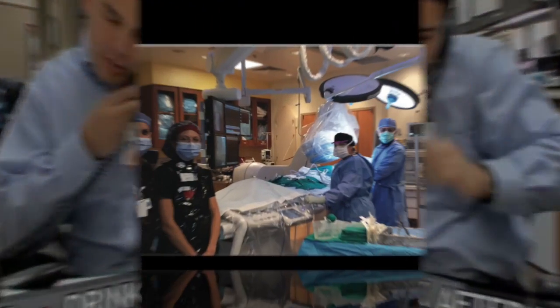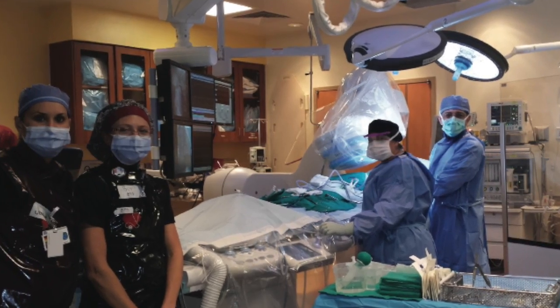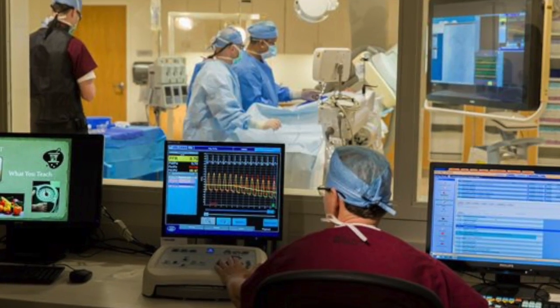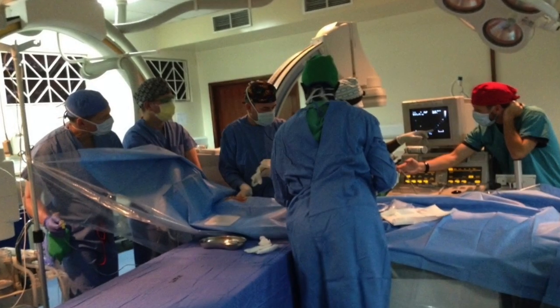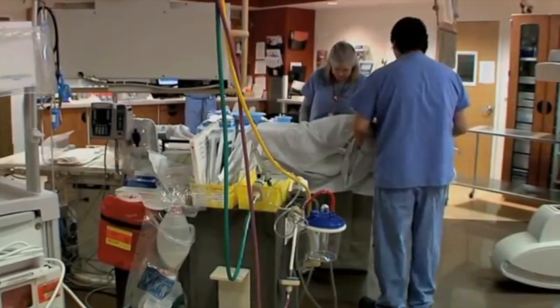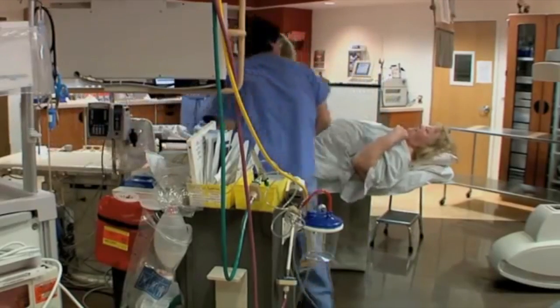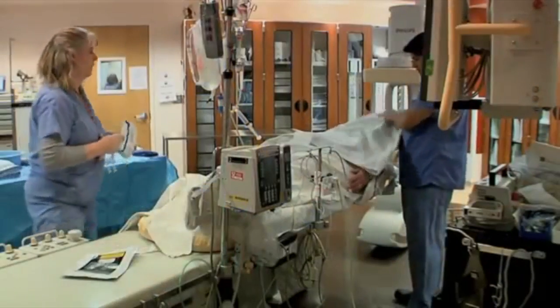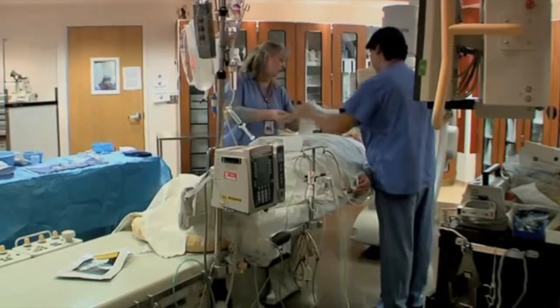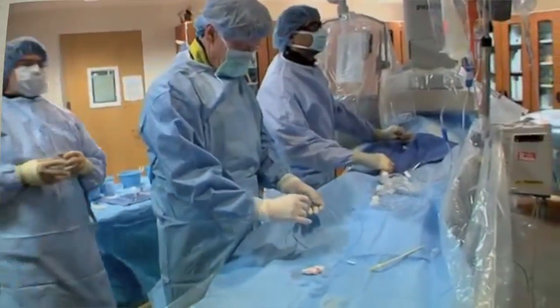Your cath lab team consists of an attending physician who is an experienced cardiologist and will be performing your procedure, a fellow who is a doctor who is pursuing further training in cardiology, a physician's assistant that is a healthcare provider who has been specially trained to assist the attending physician, a nurse who is responsible for completing an assessment prior to your procedure, and finally a cath lab tech whose role is to set up and operate the various types of equipment used by the physicians during the cath procedure.